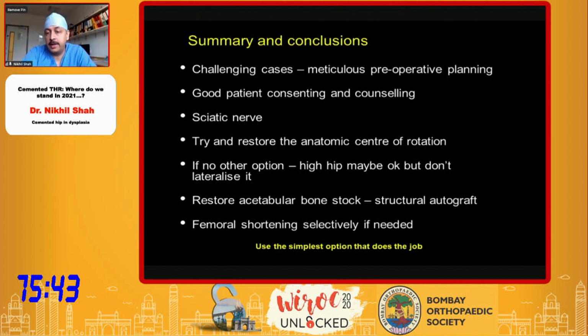Try and restore the anatomic center of rotation where possible. If there is no option, and if you have to use a high hip center, then it may be okay, but try and not lateralize it at least. Our philosophy is to restore the acetabular bone stock using a structural autograft, and I've shown you X-rays of follow-up. They work extremely well. And then selectively to use a femoral shortening when needed. So the philosophy is try and use the simplest option that does the job the first time.